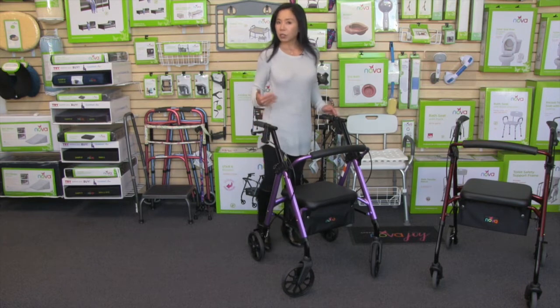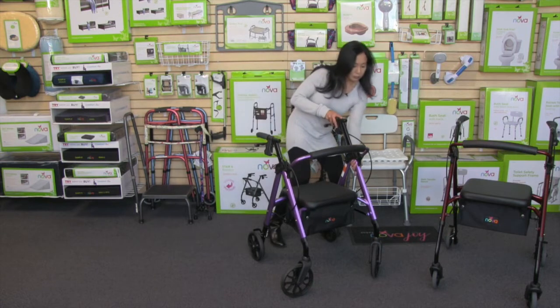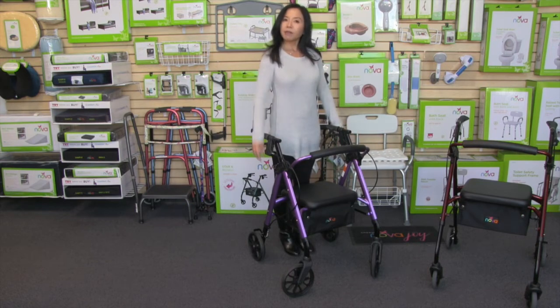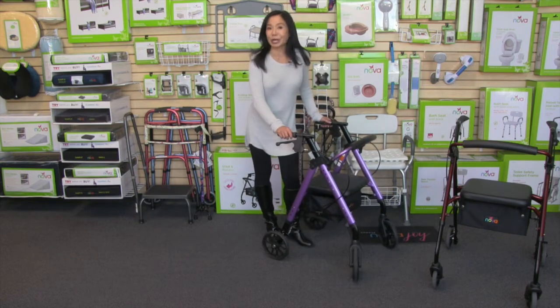So these handles are a little bit too high for me. So I'm going to lower them a few notches. All right, that feels just about right. So now I've got a walker that is sized perfectly for me. So now this is a good time for me to show you the great features of the Star.